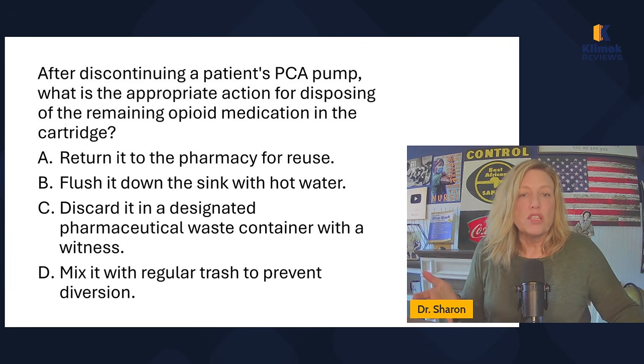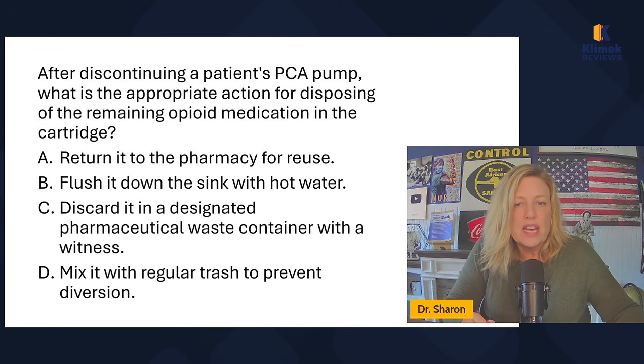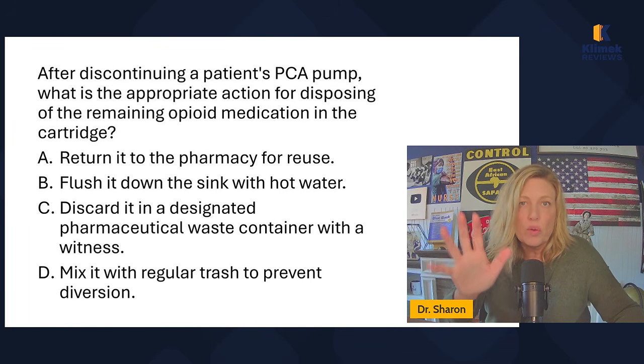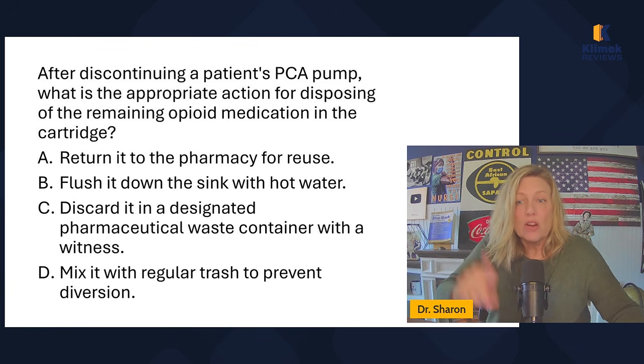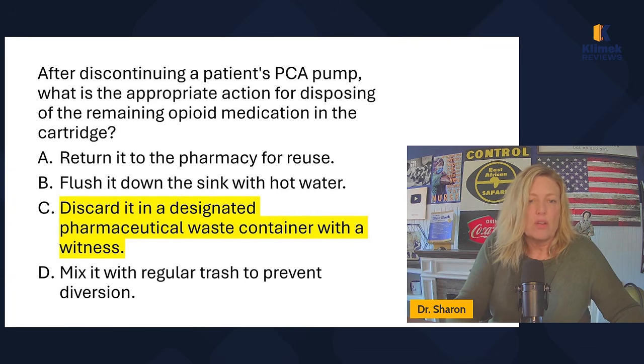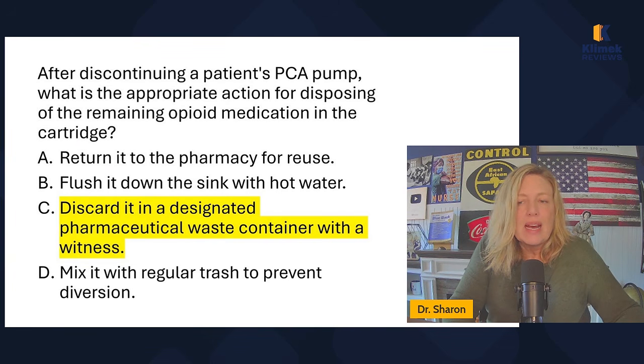So we have a partially used cartridge, which means I can't just send it back to pharmacy. Okay, I have to dispose of it. Return to pharmacy. No. Flush it down the sink with hot water. No, there's no witness there. You got to have a witness. Discard it in a designated pharmaceutical waste container. Yes, with a witness. There we go. Mix it with regular trash to prevent diversion. No. Okay, so I'm just showing you that the same concept, the right answer is the same answer, but it's slightly different wording.